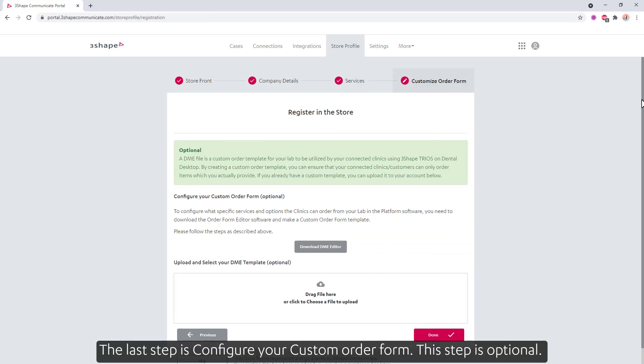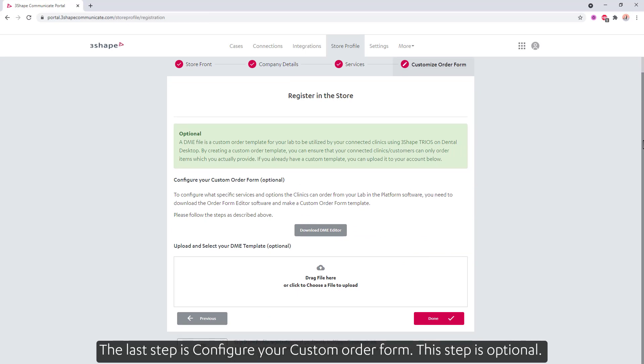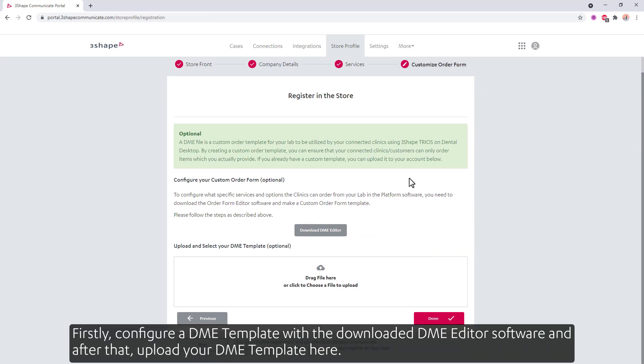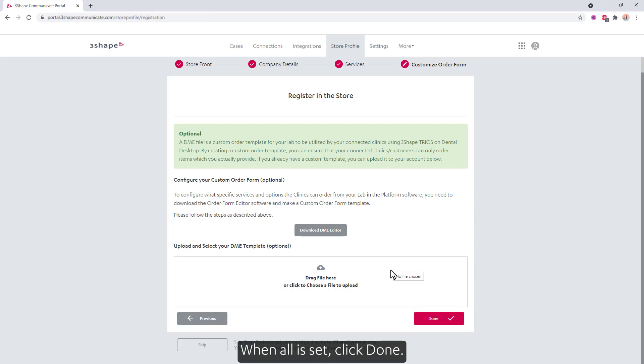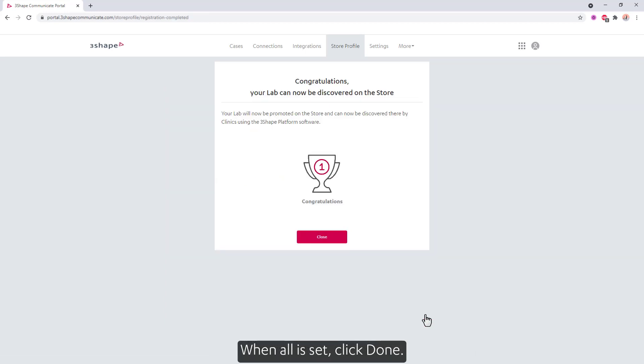The last step is to configure your custom order form. This step is optional. Firstly, configure a DME template with the downloaded DME Editor software. After that, upload your DME template here. Note that you can use the Previous button to make changes during that process.